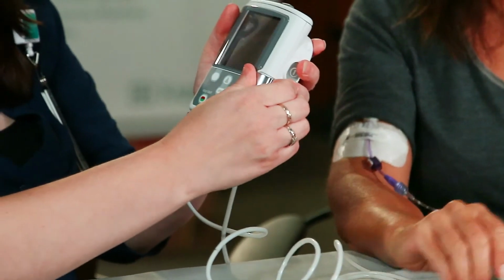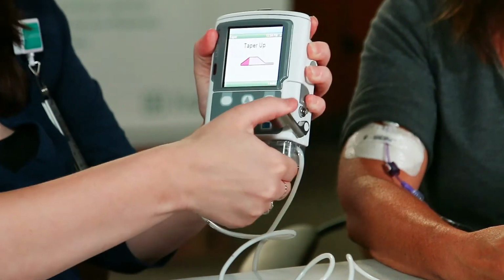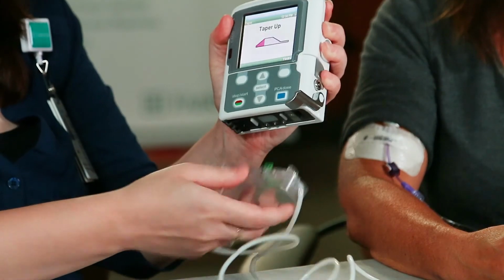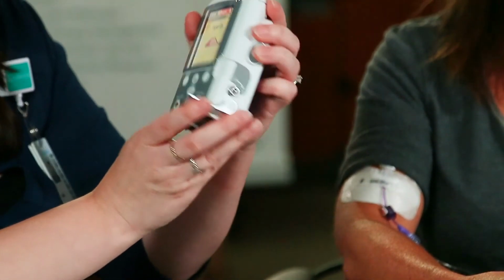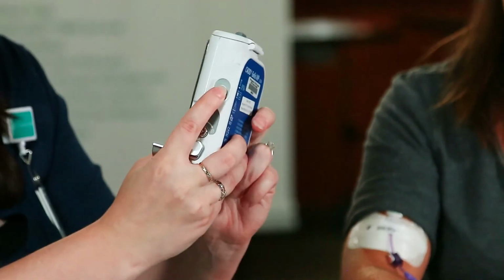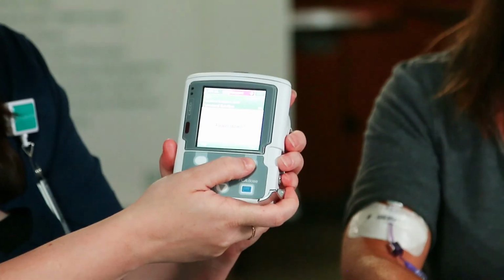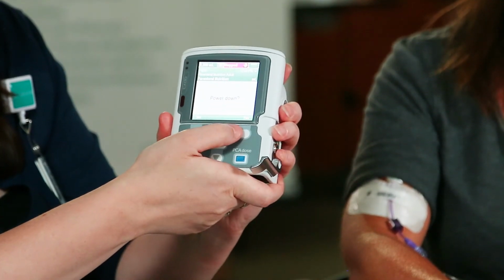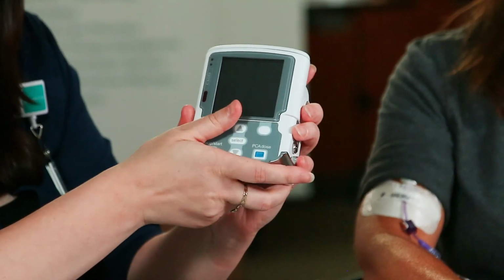Remove the cassette from your pump, pulling the latch lever down. Turn off the pump using the on and off button located at the side of the pump. A message will display power down. Select the soft key under yes to turn off your pump.